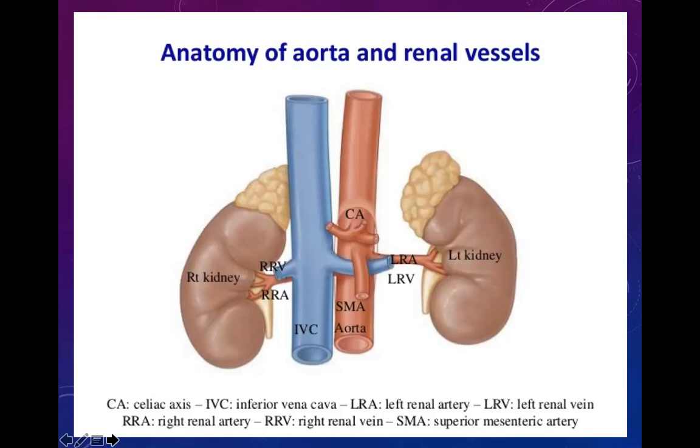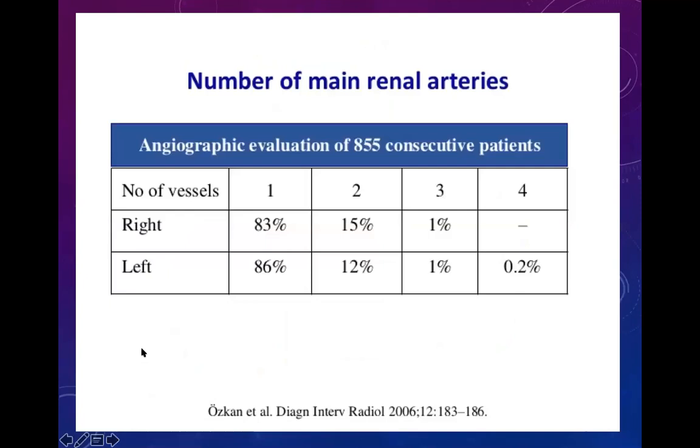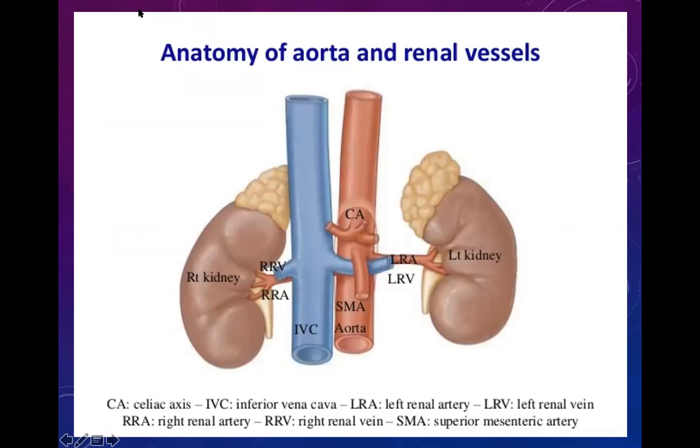And many anatomical abnormalities like nutcrackers and retroaortic veins, we can see by a very patient examination if we do that. So the veins are always... So this is the anatomy of the arteries and the veins in the abdomen.